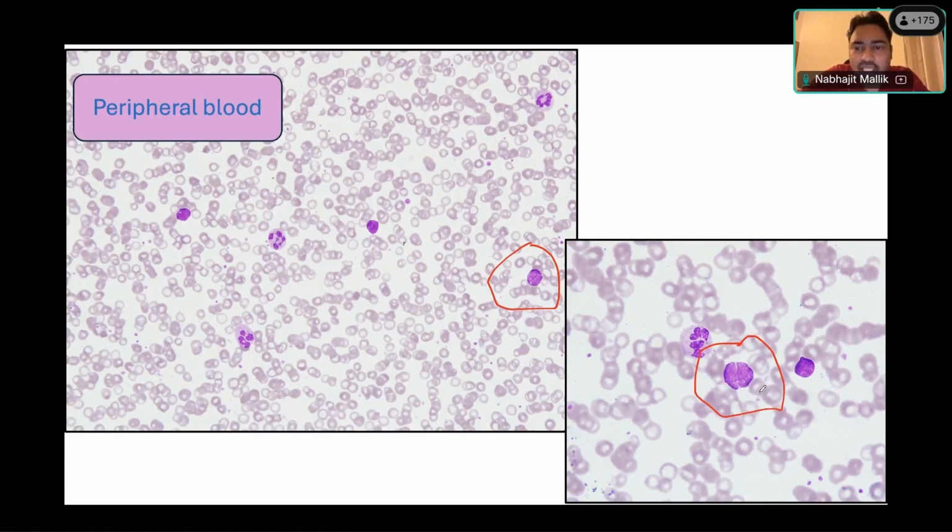So do you think the nuclear cleaving is common in a reactive lymphocyte or a non-reactive neoplastic lymphocyte? The first question was, what do you commonly see in a reactive lymphocyte? How do you identify a reactive lymphocyte? Granulations in the cytoplasm can also be seen in reactive lymphocytes. More commonly, what do you see in a reactive lymphocyte? It's a little bit granular cytoplasm.